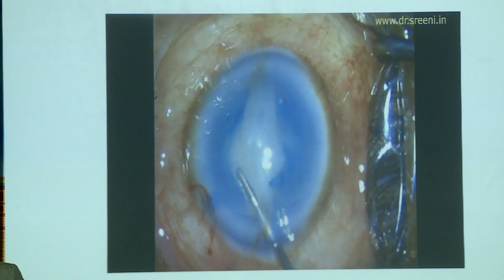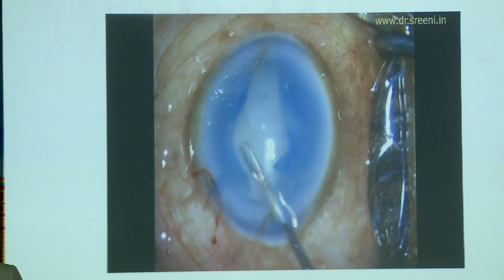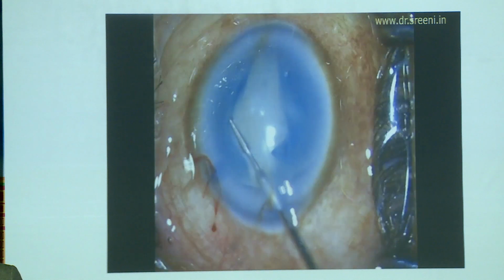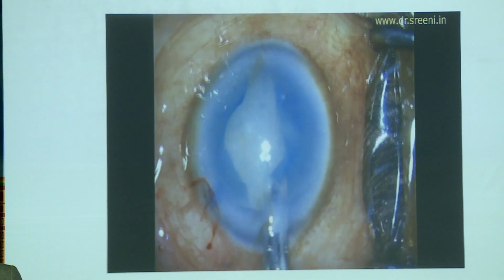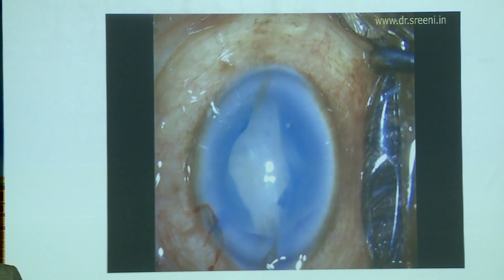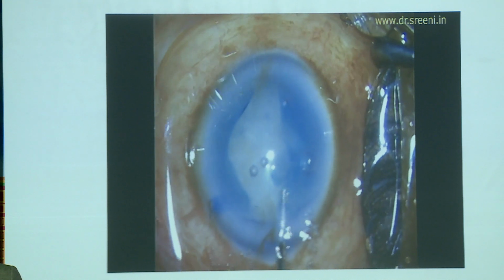If you do phaco through that, it's definite that it's going to fall down. But if you make a rhexis on both sides, you can cut it either with Vannas or micro scissors, and make the rhexis with Utrata forceps or micro rhexis forceps. So this is how you have to make space enough for safe phacoemulsification.